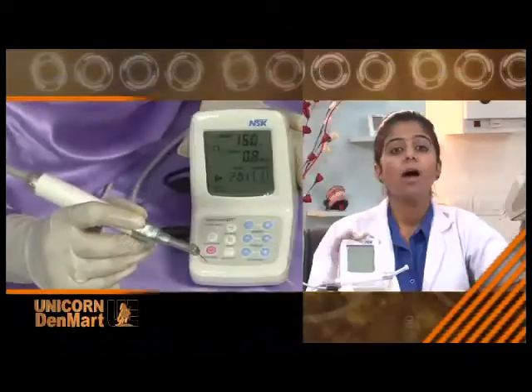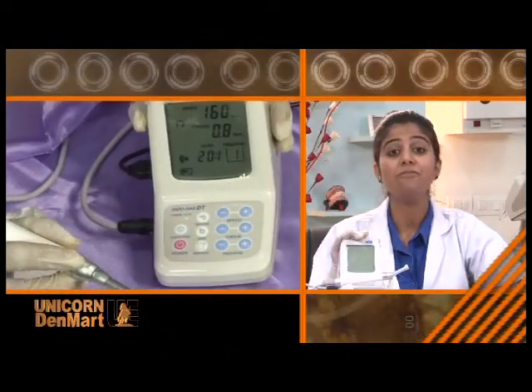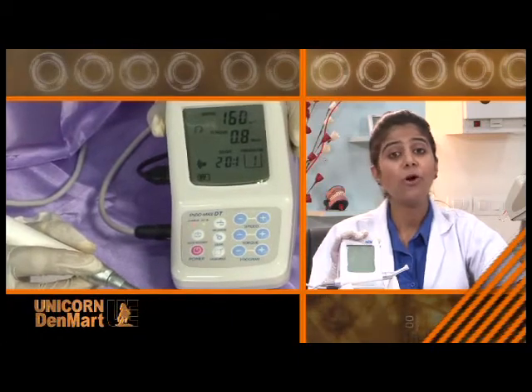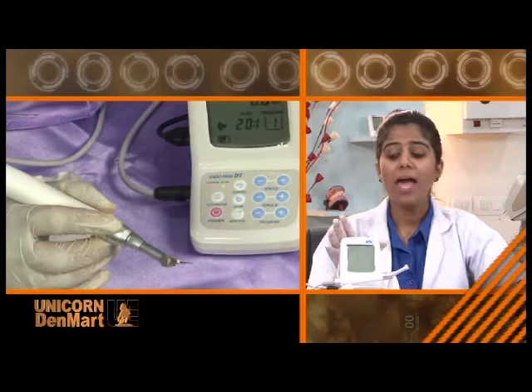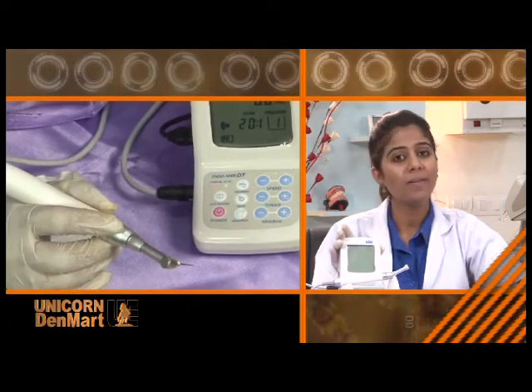During complex endodontic treatment, what a user needs is precision and perfect equipment to carry out the treatment successfully. Keeping in mind the convenience of the user and comfort of the patient, Unicorn presents Endomate DT from NSK, an endodontic micromotor which fits all brands of nickel titanium files.